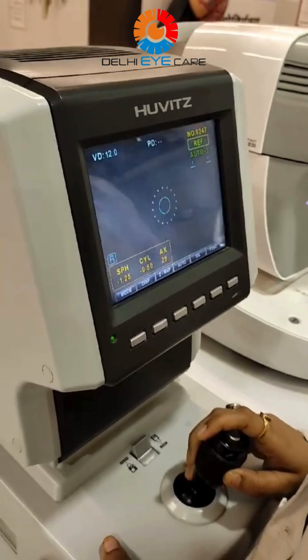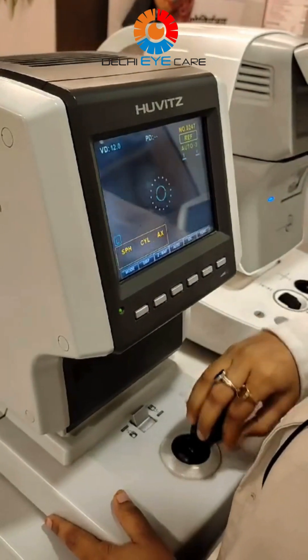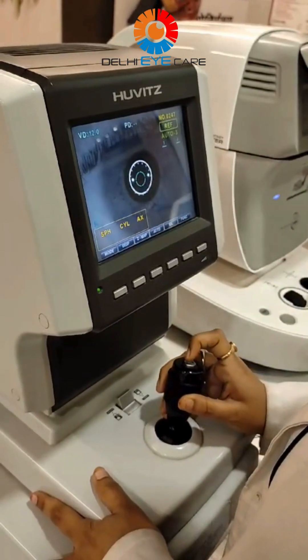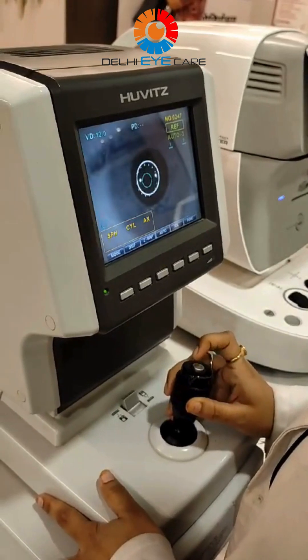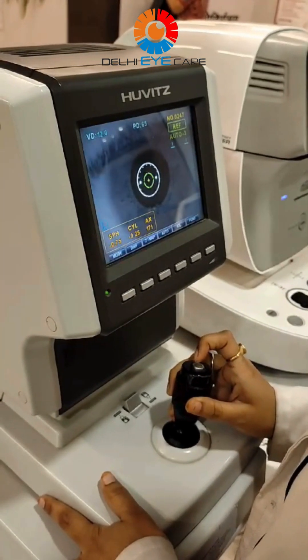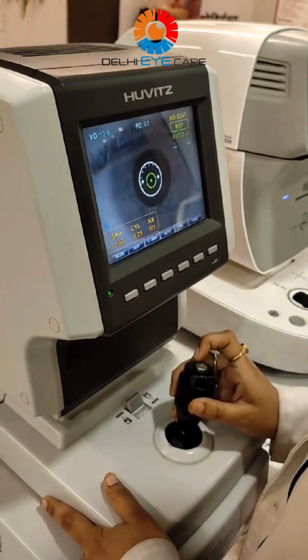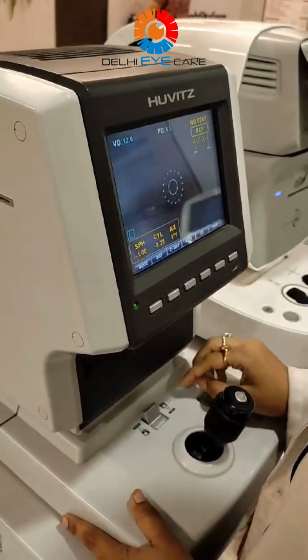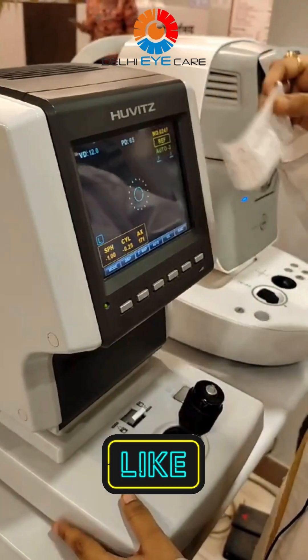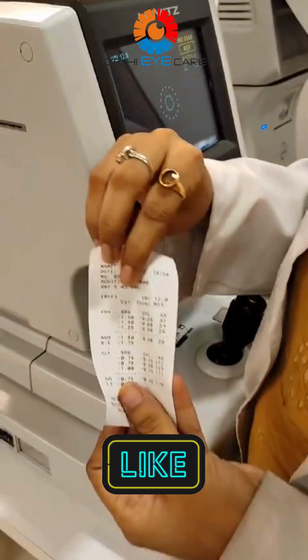We are going to take three readings for one eye and three readings for the other eye. Done — so here we have the values.